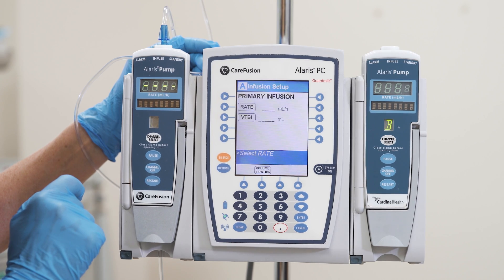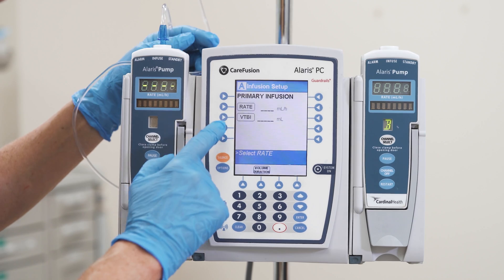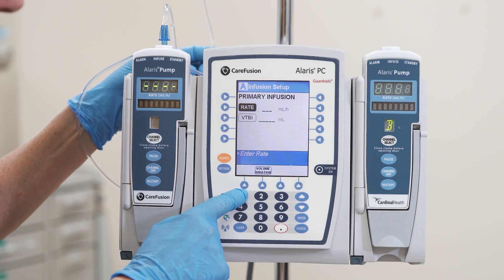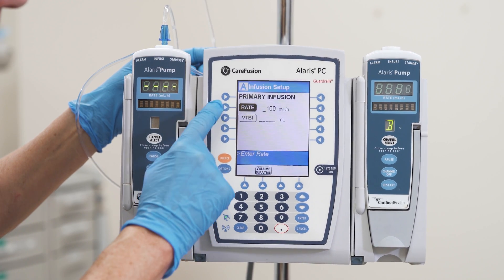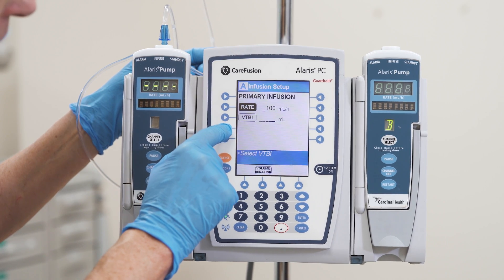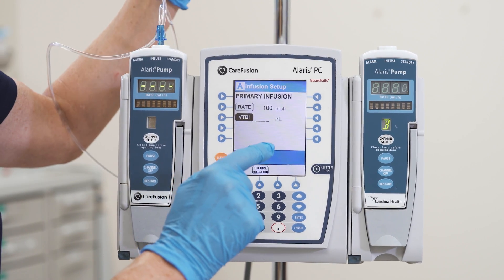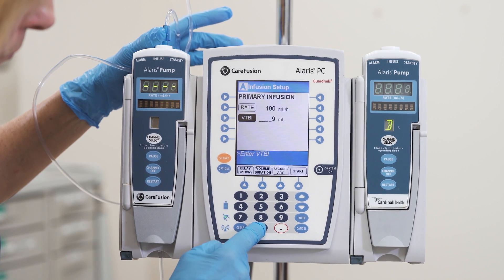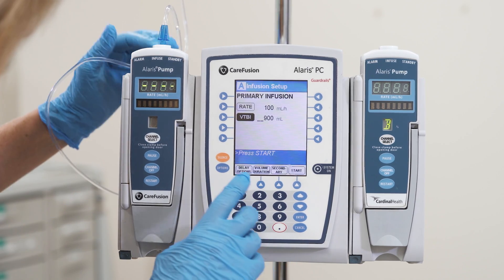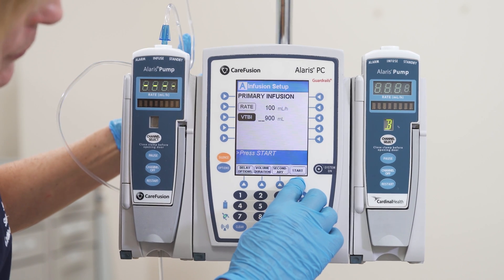I know that in the physician's orders there was an order for normal saline to be run at 100 mLs per hour. I'm going to press next to rate and enter 100 at the bottom. Next you see VTBI, which is volume to be infused. I'm going to enter 900 mLs, which is what's in my IV bag. I'll make sure all my clamps are open and press start on the bottom right of the main screen, and my IV solution will be infusing.